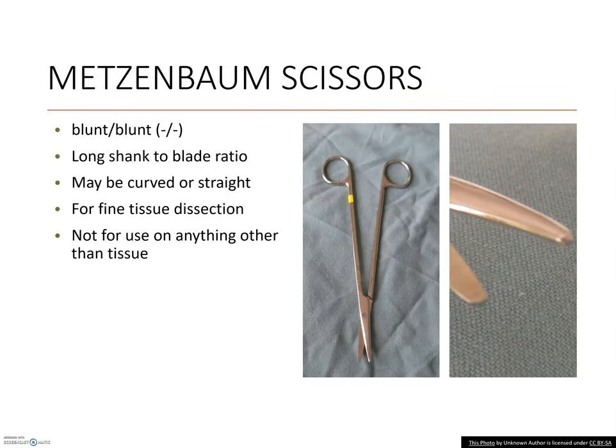Metzenbaum scissors are notably long. The comical part is the length of the shank between the ring handles and the screw hinge — that very specific feature is one of the identifiers for most Metzenbaum scissors. The second identifier is the delicate thin blades. They still have round blunt tips like the Mayo's, but these scissors are almost dainty, and it's no coincidence they are designed for thin and dainty tissues. The length is an added benefit for reaching deep into cavities without losing precision.